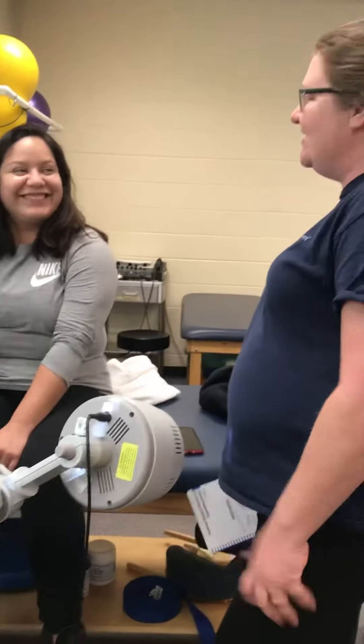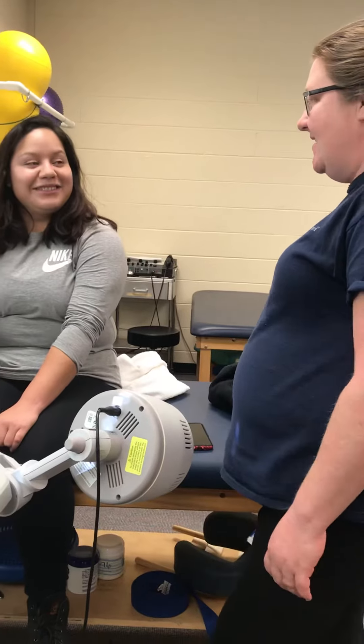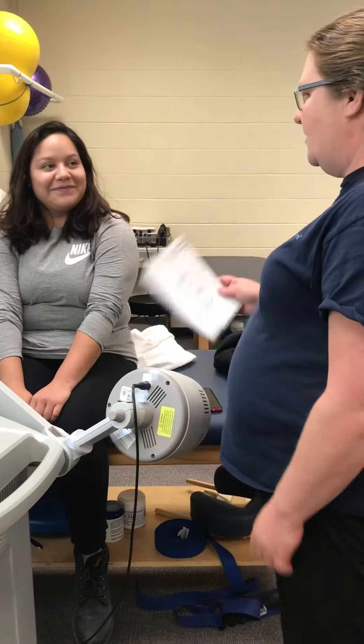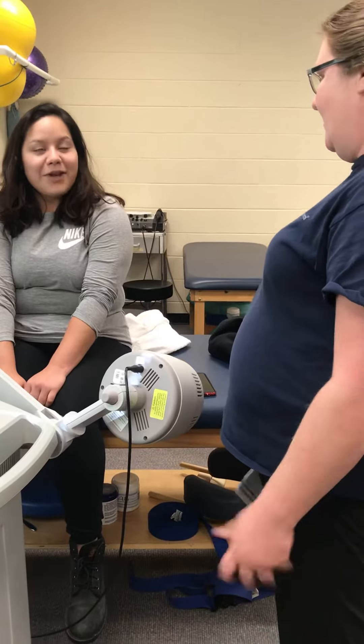Hey Ruby. Today we're going to do some diathermy with the pads on your right hand. That's going to increase your range of motion a little bit. So we're just going to be putting some pads on your hand and you'll just feel a little warmth. It's common.